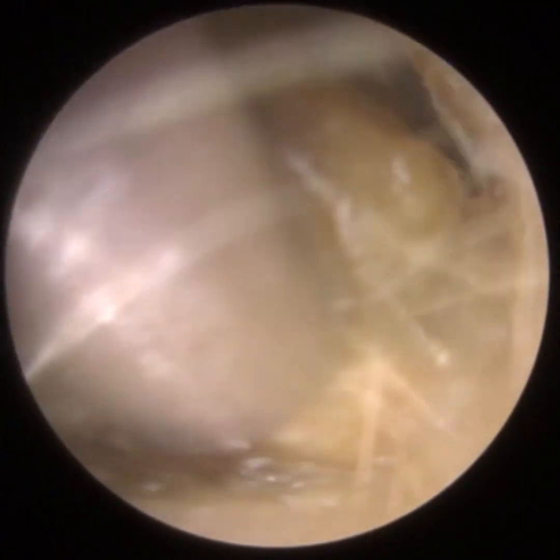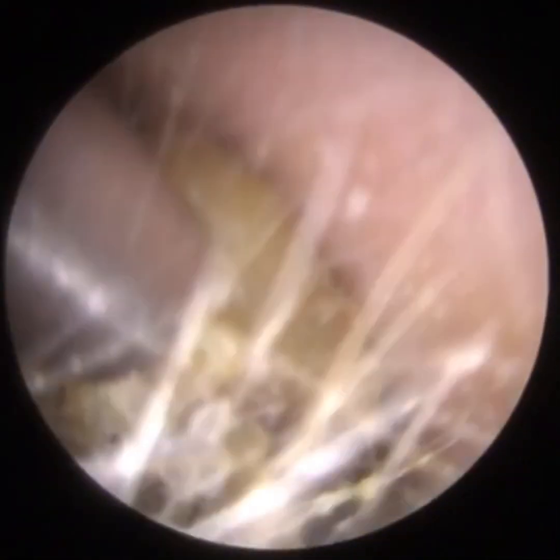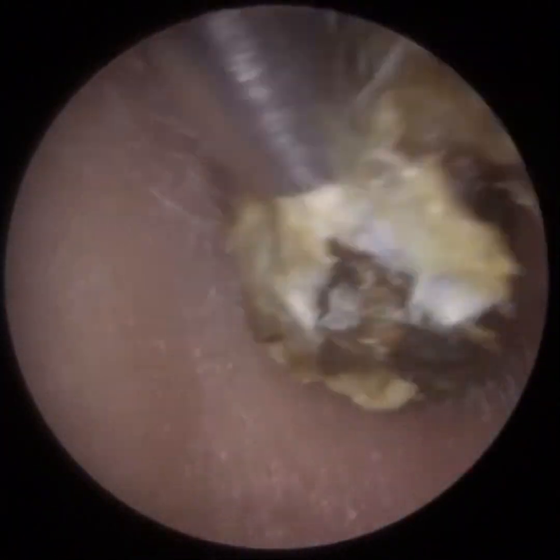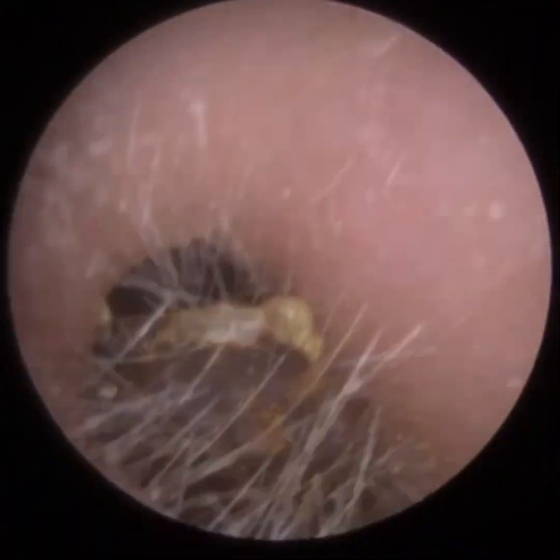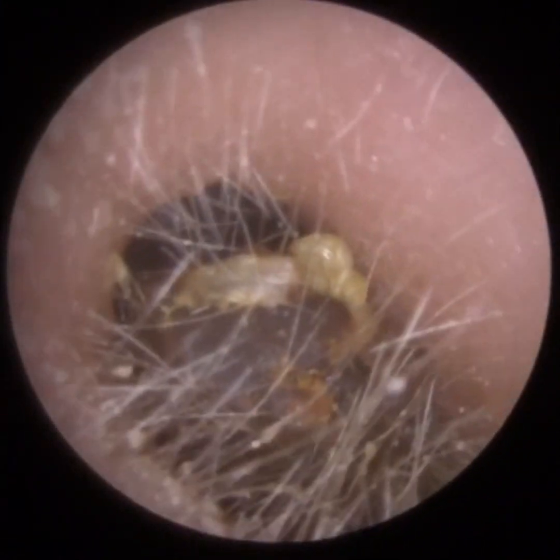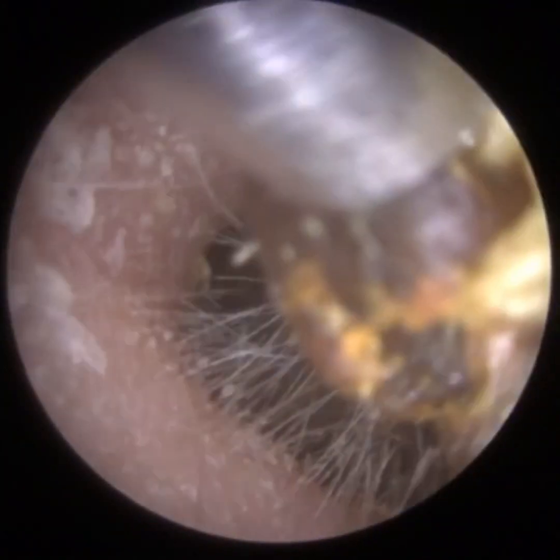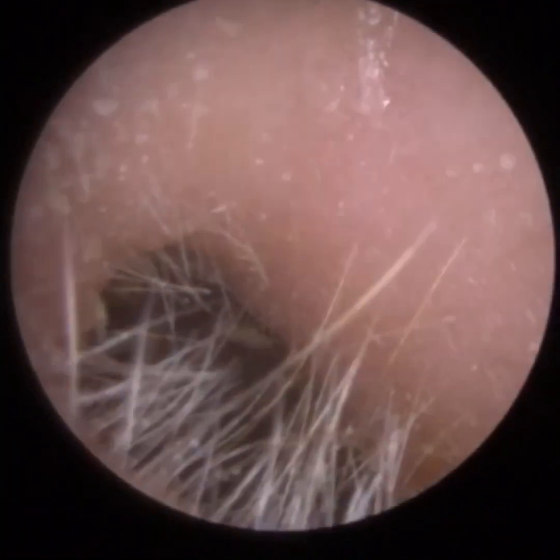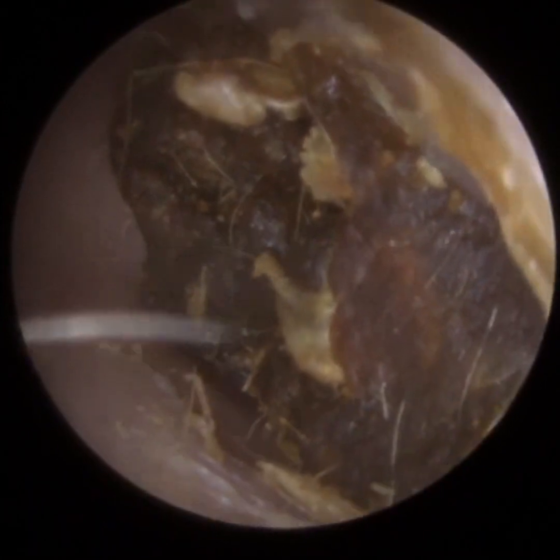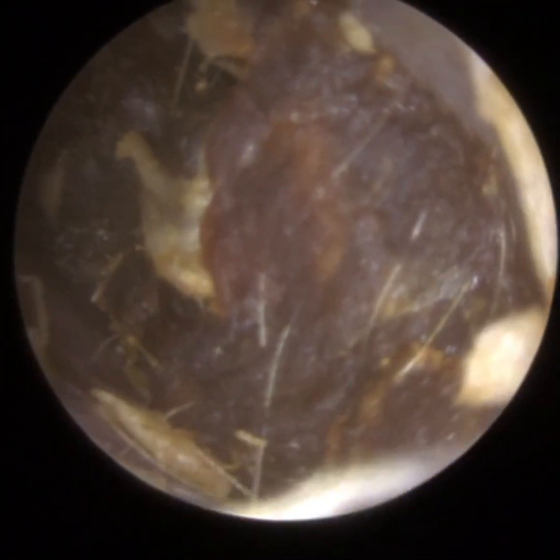We're just in the right ear, which is the worst ear of the two. Now, when you have dry earwax, it could be due to the patient having a specific gene mutation. There are generally two types of earwax — dry and wet — and what determines whether you have dry or wet earwax is actually a mutation, a specific mutation on the ABCC11 gene.